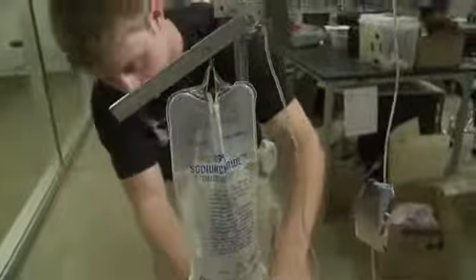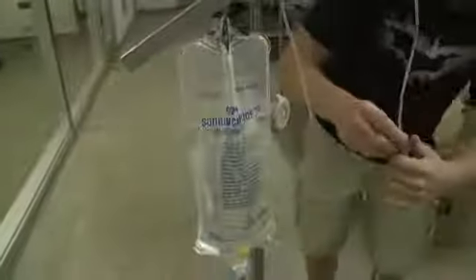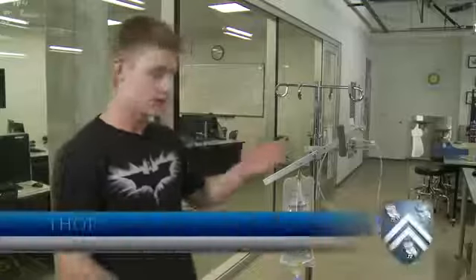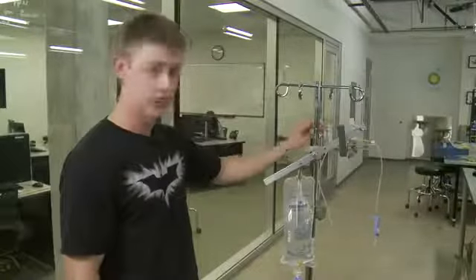Overhydration can cause death. And so what we needed to do was to create a device which would autonomously regulate the flow of fluid to a child and shut off fluid after a certain point. A physician would set up our device, IV Drip, in 3 simple steps. First, they'd permanently attach it to either a wall using bolts or any size IV pole using hose clamps.